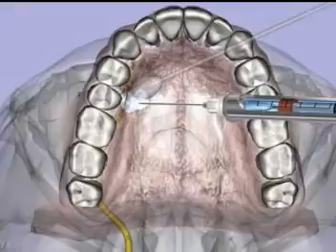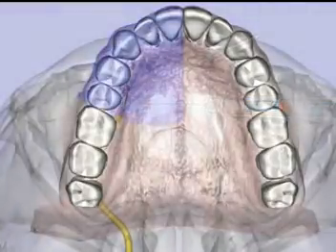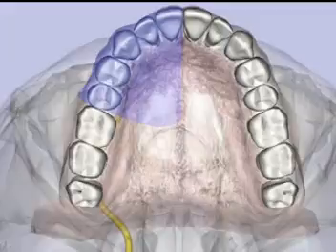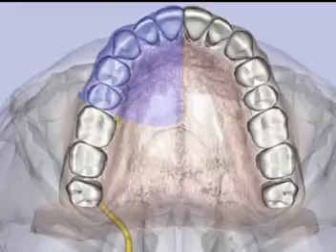The anterior middle superior alveolar nerve block provides pulpal anesthesia to the maxillary incisors, canine, and premolars on the side of the injection, their supporting buccal soft tissues and bone, and the palatal soft tissues and bone adjacent to these teeth.